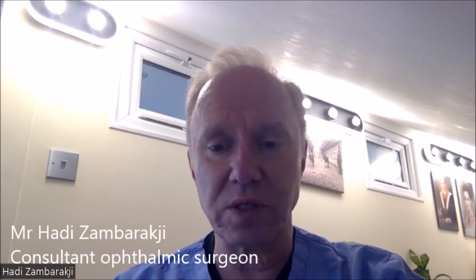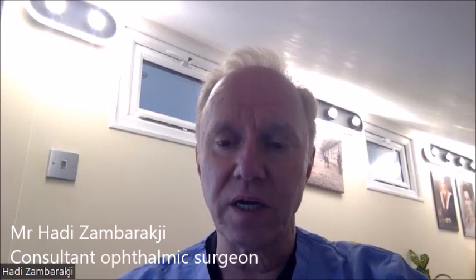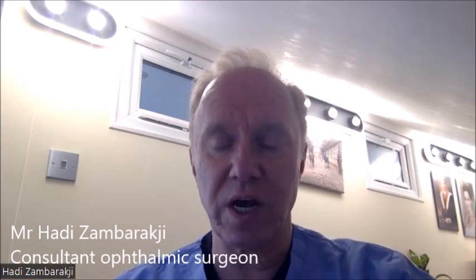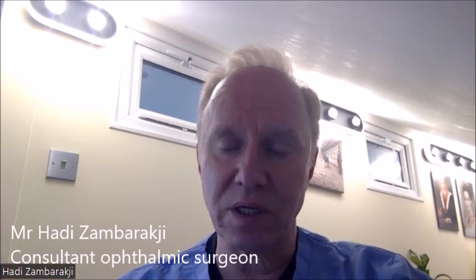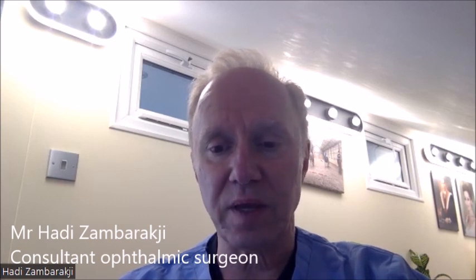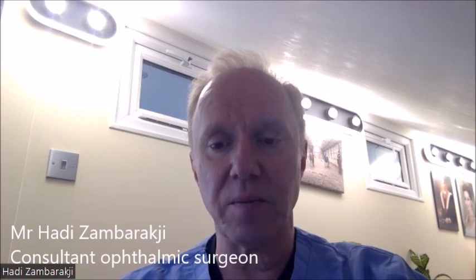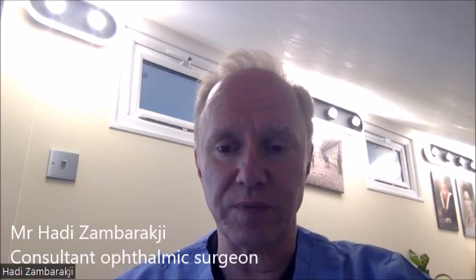So in other words, in terms of numbers, if you aim for 0 for the distance eye, then for the fellow eye, you can aim for a correction of minus 0.75 or minus 1, which therefore means it's a small difference between the right and left eyes, whilst it will still achieve good distance and near vision. The key thing with monovision correction is that it is absolutely essential to get the first eye, i.e. the distance eye, perfect for distance. Otherwise, you cannot do monovision correction anymore.